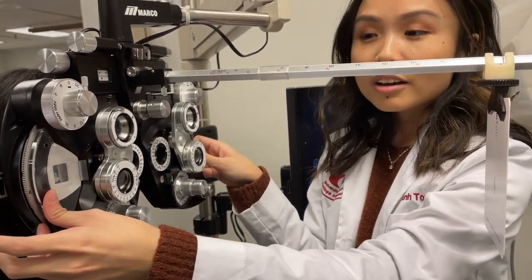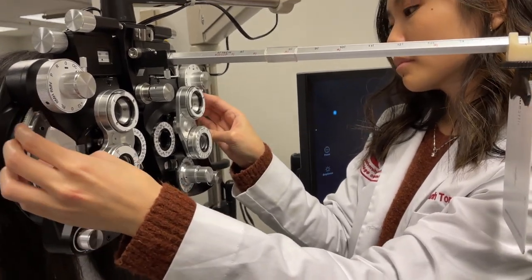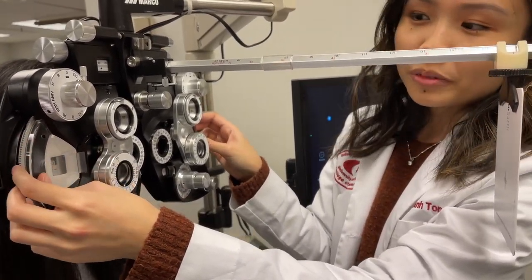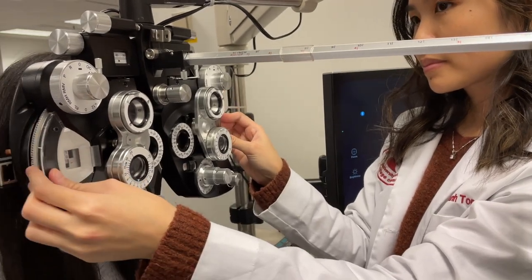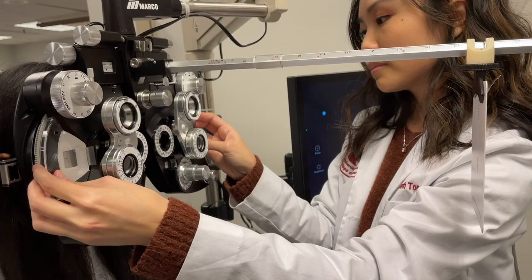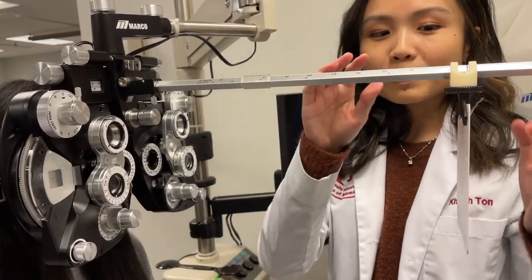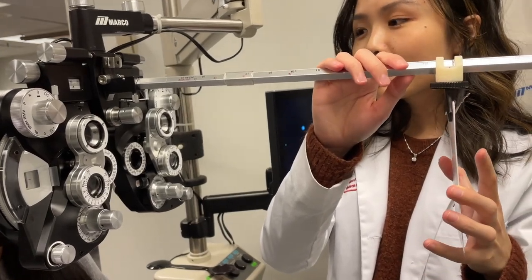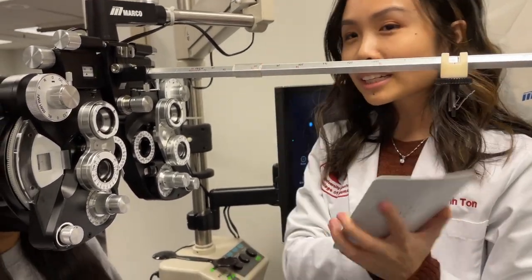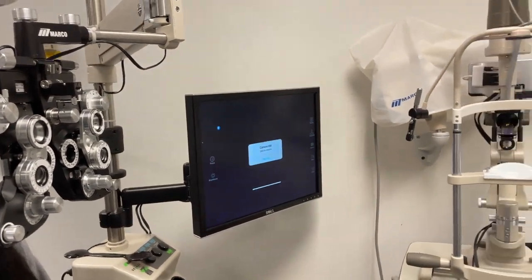That's going to be an NRA of plus 2.5. All right, Mrs. Lee, we're going to do this one more time, okay? Mm-hmm. Now it's blurry. Okay, and you can sit back. And that's going to be a PRA of minus 2.5, which means they're balanced, which is within normal limits. And that would be the end of this station.